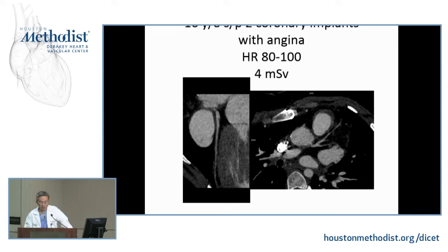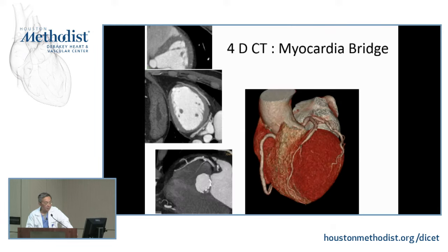Again, for coronary anomalies or post-surgical changes in adult congenital patients, CT is becoming one of the most useful technologies because now we can administer very little radiation, and the key factor is it's real quick. All these tests can be performed in less than a minute.